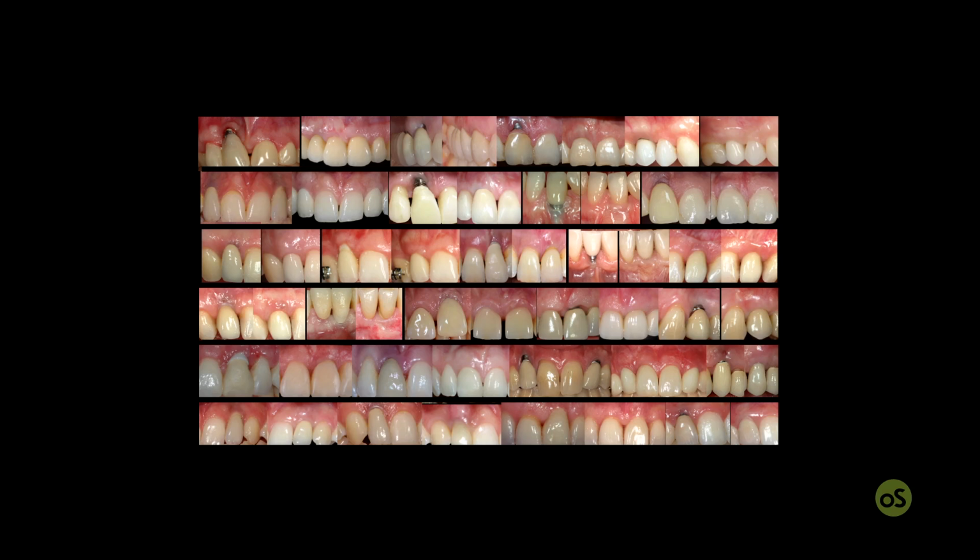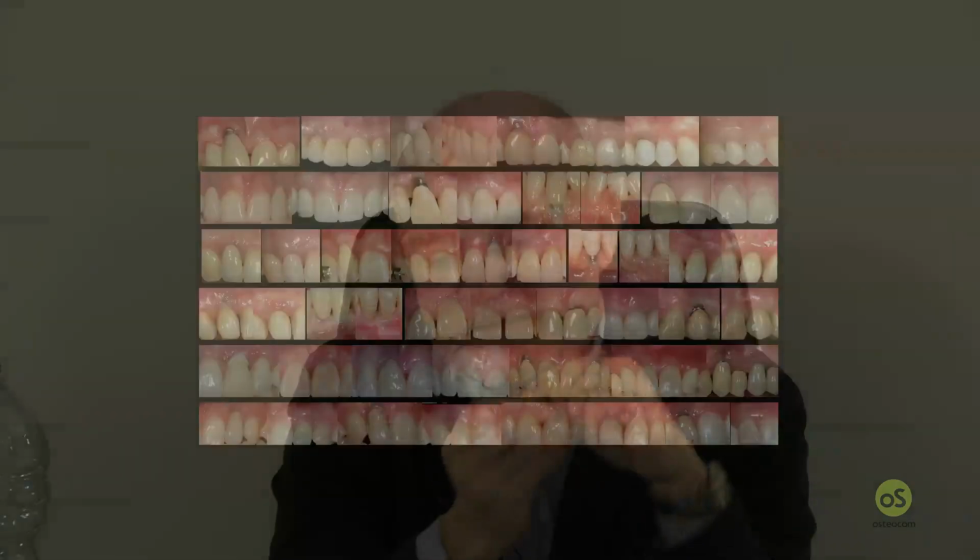So now we can start the treatment of the soft tissue dehiscence around the implant. It's something that I started more than 10 years ago, and for many years I did not publish and did not show these clinical cases because it seemed impossible to treat this exposure of the implant surface, this misalignment of the soft tissue margin at the level of the implant-supported crown, with the soft tissue only, without speaking about bone or bone substitute.